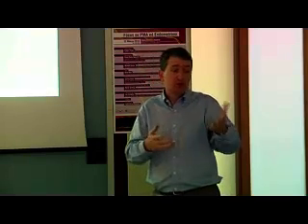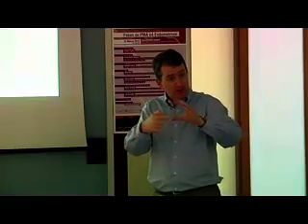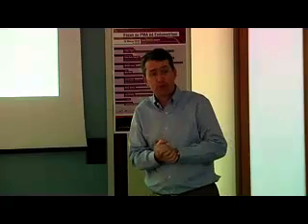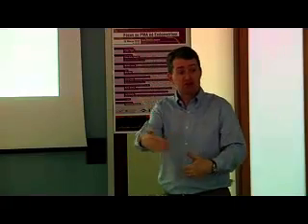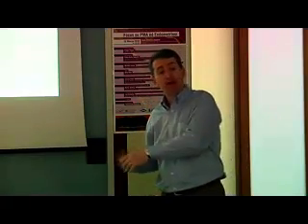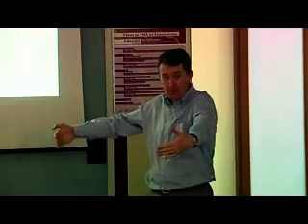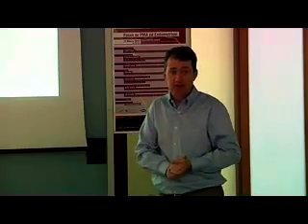Yeah, because to do the ICSI needle, you've got to set up the micromanipulators, and it takes time and effort. If you make up a collapsing solution with some 0.1 molar sucrose, then you just put them into that solution for a minute, and then you carry on and go through the vitrification process. So I'm a big advocate of doing it for those big embryos, and there are different ways to do it if you have to.